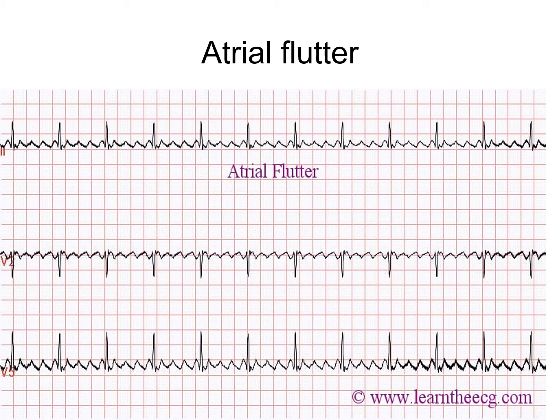So the flutter wave should not actually be confused with P waves. I've read a couple different things where these really aren't P waves, more of like a flutter wave.